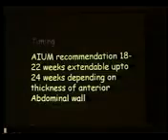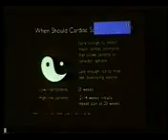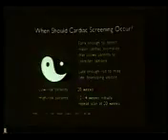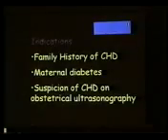And if it is more than 2 centimeters, say 3 centimeters thickness of the anterior abdominal wall, it's quite possible to miss those entities which we are going to discuss. Low risk patients at 20 weeks and high risk patients between 12 and 14 weeks is the recommendation by the AIUM. So that's what we have to work on.